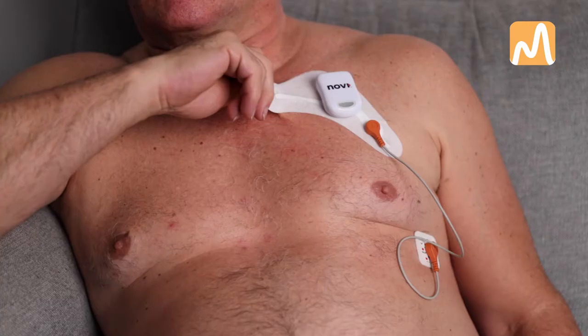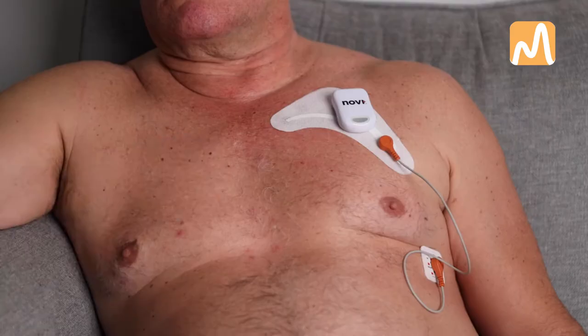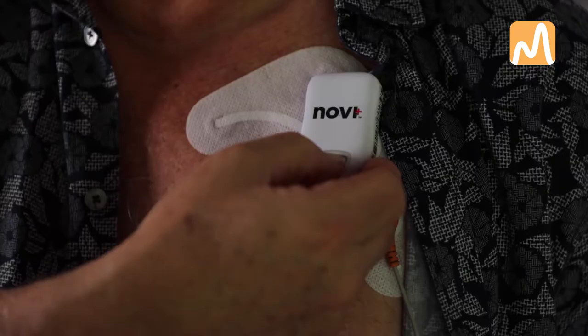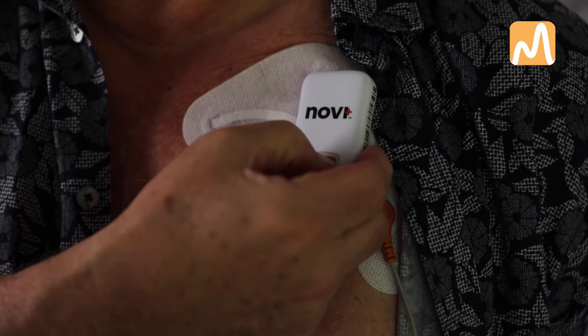To ensure optimal quality of your test, please do not rigorously scratch the area or pull on the edges of the patch. If you experience itchiness or skin irritation, try applying a cold compress, an ice pack, or use small gentle rubs. Never press and hold the power button. This will turn off the device.